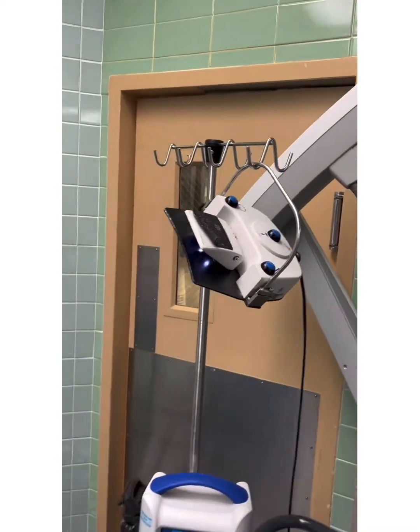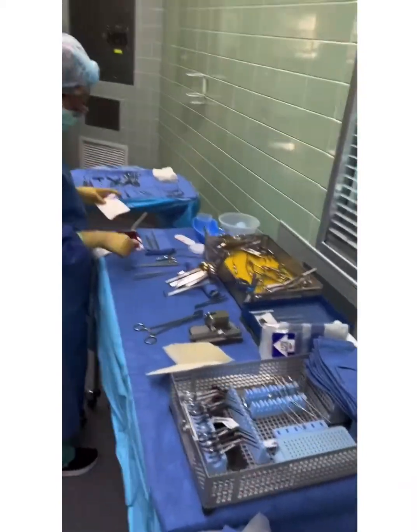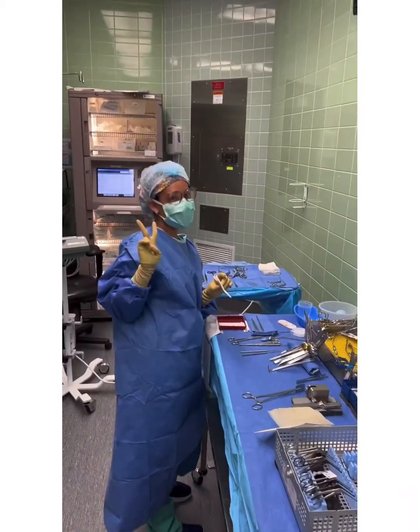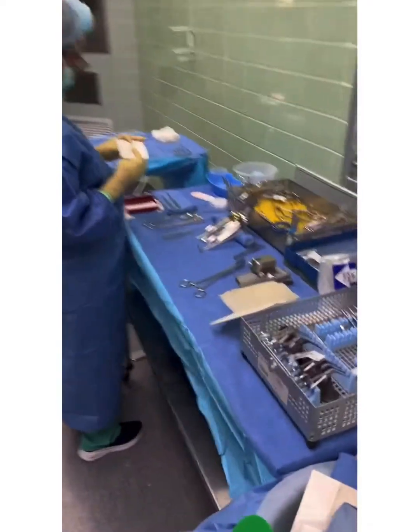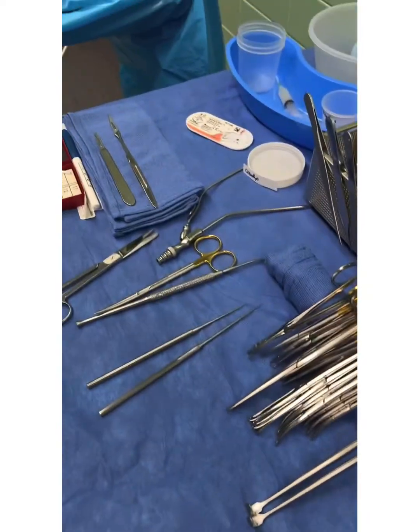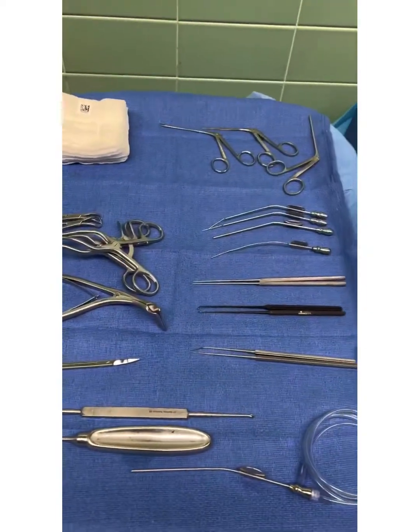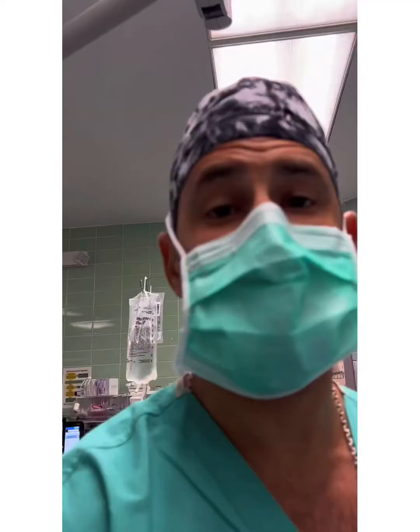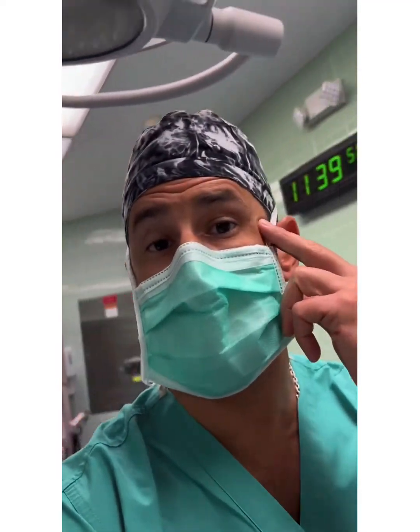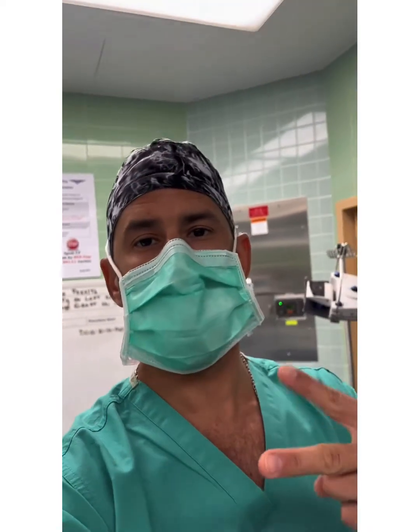This is our drill right here in case we have to drill some bone away. We have our instrument set up right here and the lovely Julia, my surgical tech. We got all these tiny little instruments right here that we use for ear surgery — very microscopic stuff, little suctions — and we have a facial nerve monitor that we use to monitor the movement of a very important nerve in the ear. I'll try to show you guys some more details of the surgery as we go along.